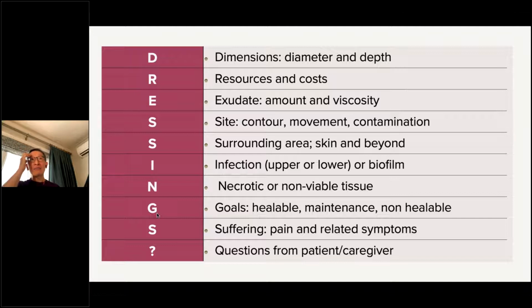And one of my pet peeves, and one of the most commonly raised complaints about the use of any type of dressing for coccyx injury, is that those dressings have a tendency to roll up, they tend to detach, they tend to get contaminated by stool, urine, and other material. So as a result, they come off very easily. So I think we just need to think about other types of dressings that have a better ability to conform to contour and stay on the skin. So that's a big factor.